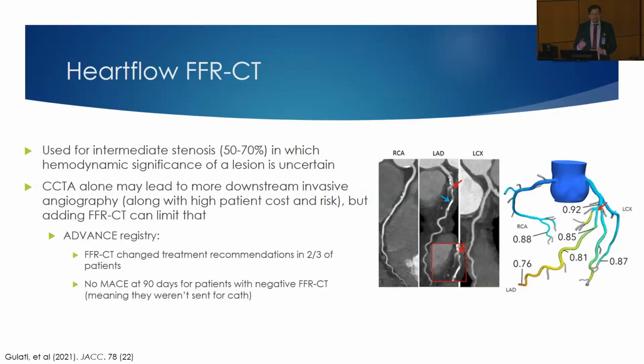It's been compared head to head against patients getting heart cath and FFR, and it's been very miraculous. Patients who come to you with a coronary CT, those patients previously that were getting those intermediate blockages, 50, 70%, you didn't really have a choice but to send it for a heart cath or maybe do another stress test to see if that lesion is functionally significant or not. But now we can do more processing. We send it to the company HeartFlow, and they process it. They put it through their magical machine learning algorithm, and it pumps this back to us.